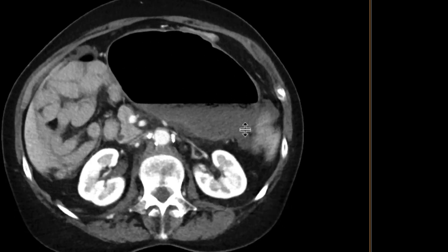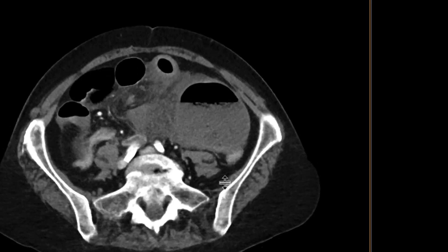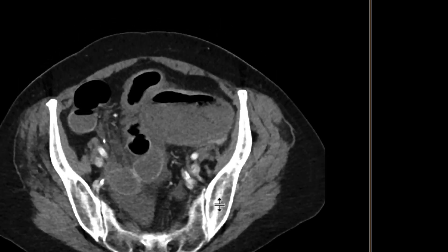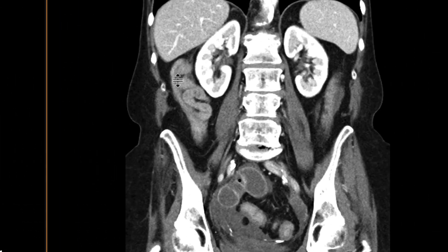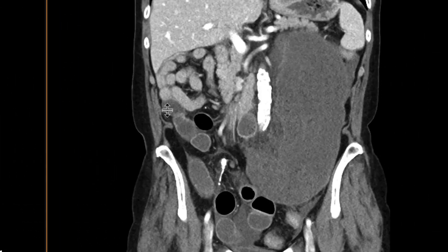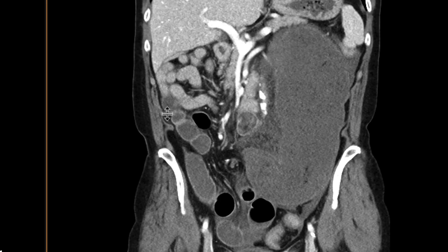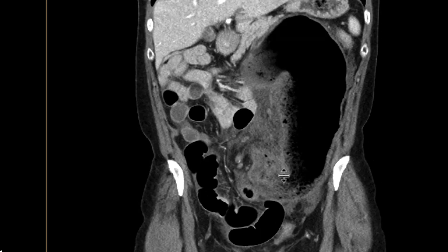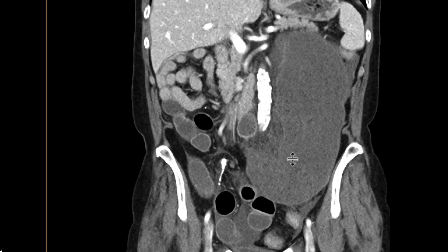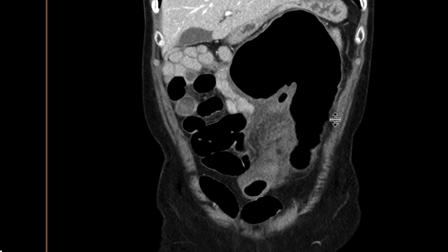So this is a large loop of cecum that's quite distended. It has an air-fluid level and a lot of inflammatory change surrounding it. Looking at it on the coronals, we can see that it has a reverse C shape. Right at the area of twisting, you can see a bird's beak appearance — that's where the cecum is twisted upon itself. Upstream from that, it is quite distended.